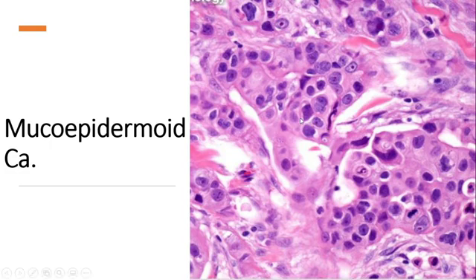All features of malignancy can be seen here. Pleomorphism, you can identify pleomorphic cells. Each cell has its different shape, size, and nuclear size. Irregular nuclear membrane, with spikes or notches, and frequent mitotic figures, brisk mitotic activity.